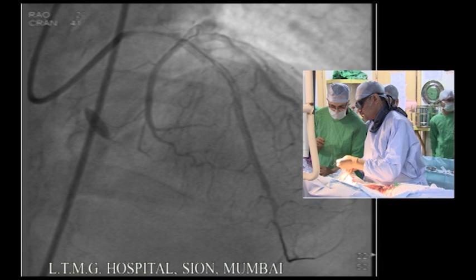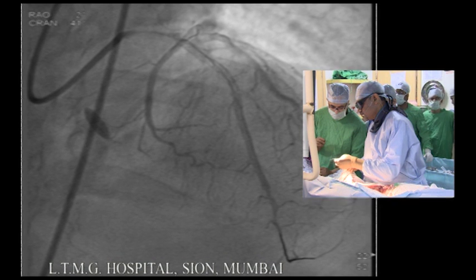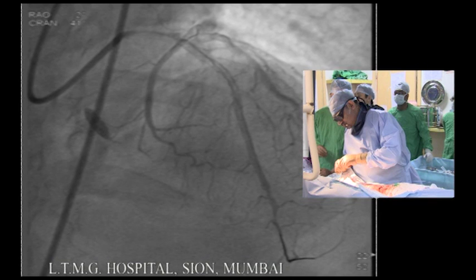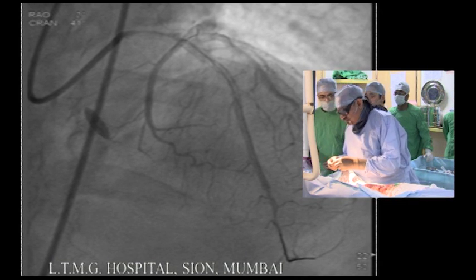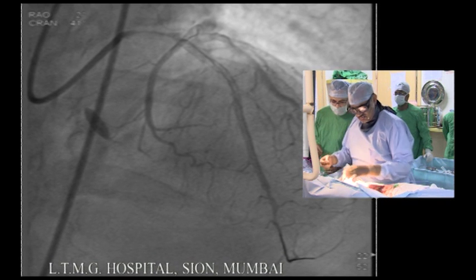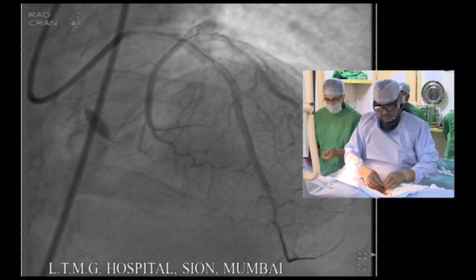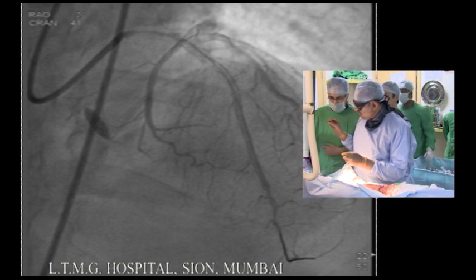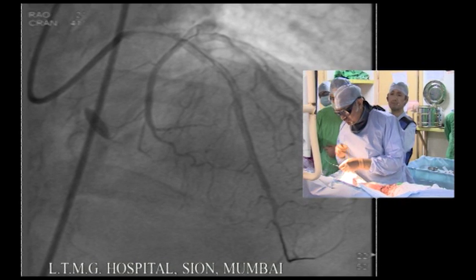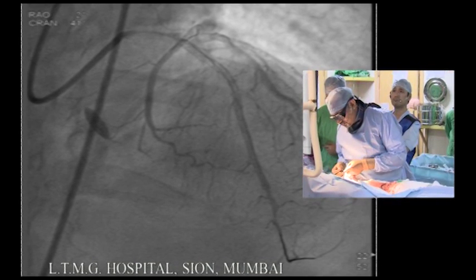I would vote for IVUS first without pre-dilatation, because if IVUS does not go in, that's a classical indication for debulking. You take your rota burr if you are comfortable and burr it. The disadvantage of blind pre-dilatation is uncontrolled dissection. And if you are pre-dilating using a very aggressive balloon, 2.75 is aggressive for this modality, then your landing zone is not going to be very healthy. So I would vote for first IVUS.